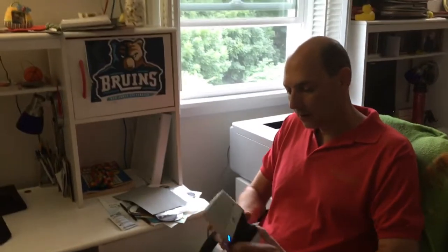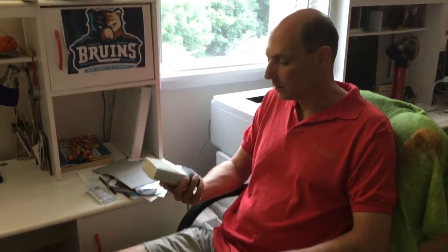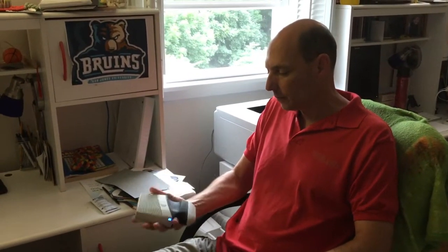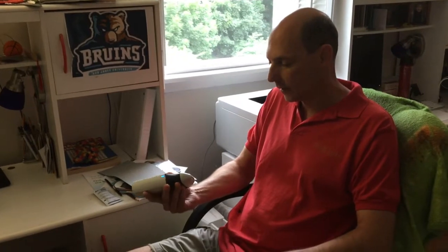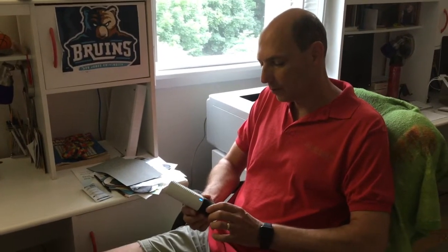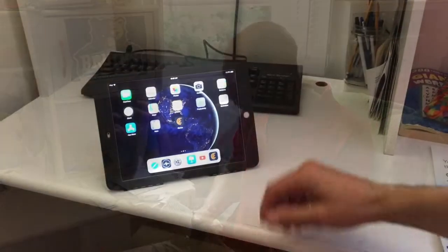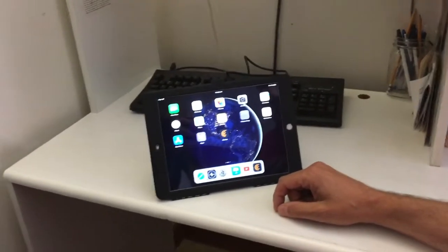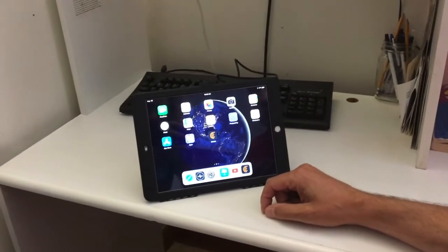This is the Clarius portable ultrasound that I got to trial — it's pretty hefty in the hand, but it is fairly portable. It's a Wi-Fi ultrasound, not Bluetooth, so it has a more robust connection. The ultrasound works with an app, available on iPad and iPhone.